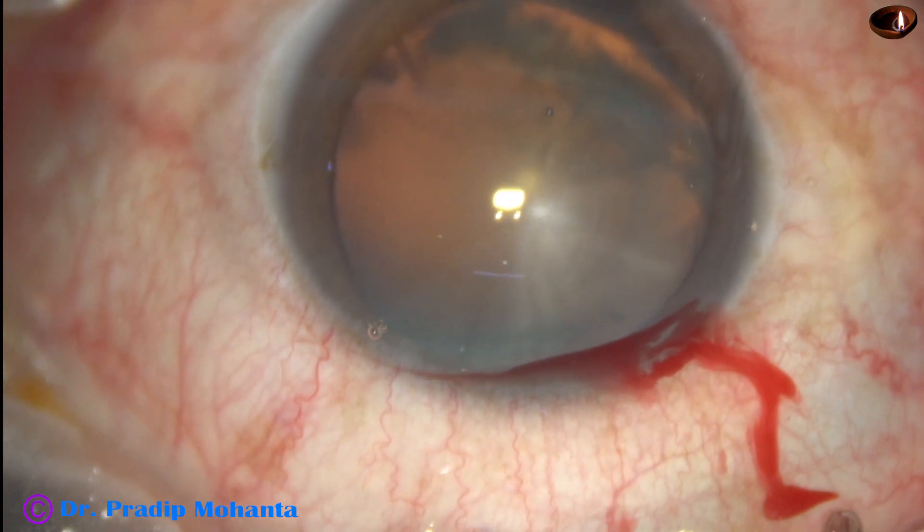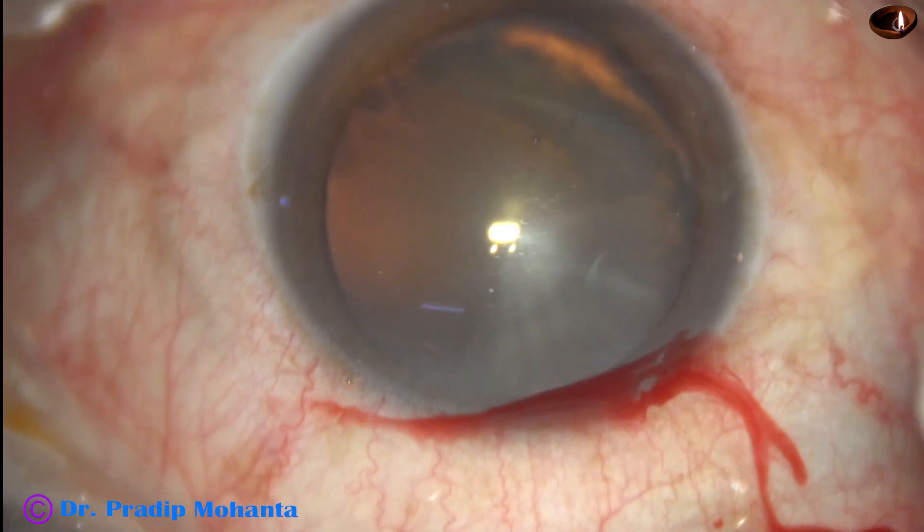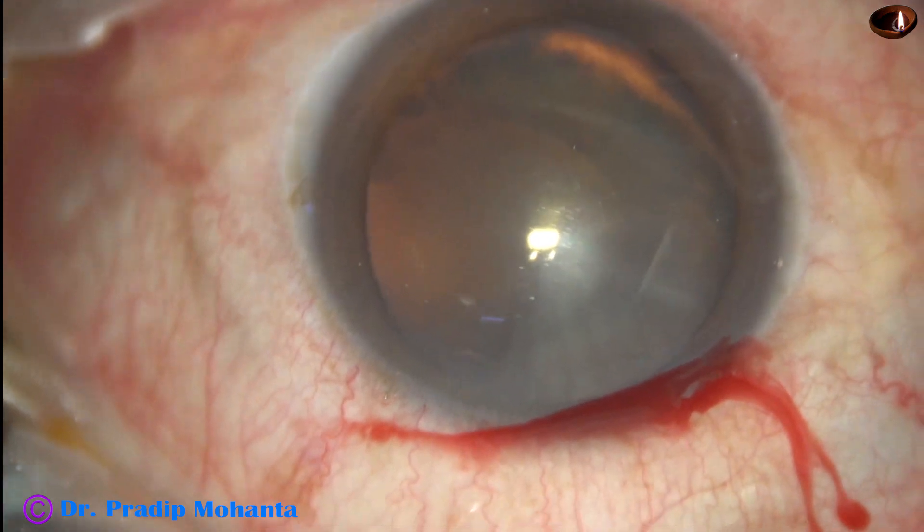The microscope is Topcon's OMS 800 and the PHACO machine is Faros from Oertly.